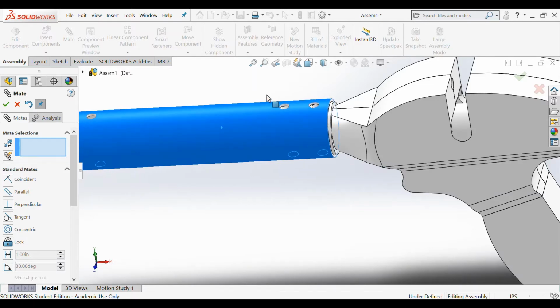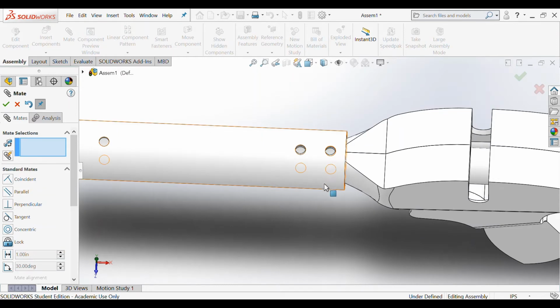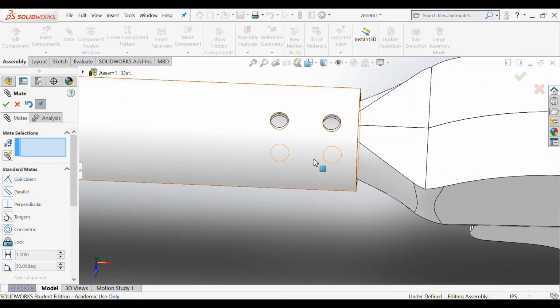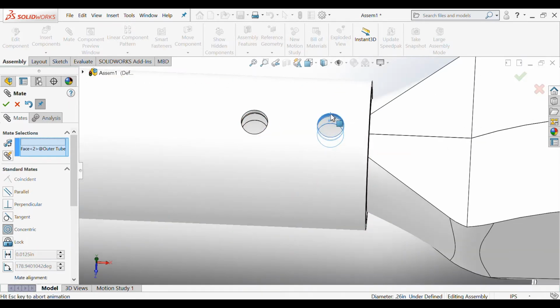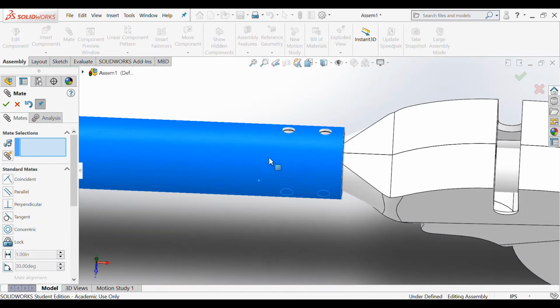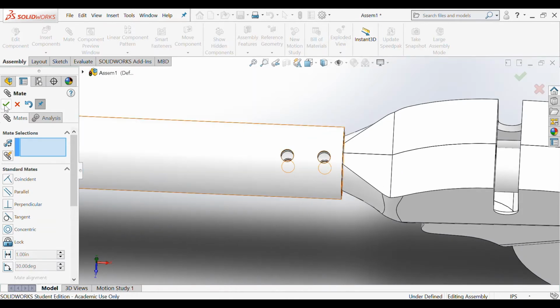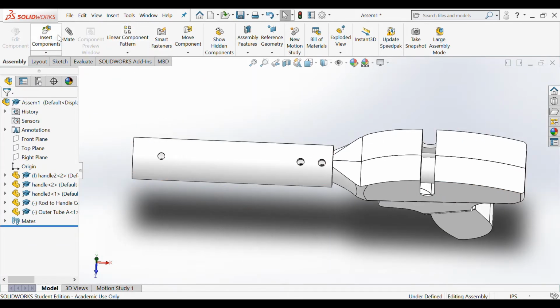Now I'm going to go ahead and rotate this guy. And we want these two holes to always stay aligned so we can put our bolts through it. So I'm going to go on ahead and click on the inner circle of the connector and then the inner part of the circle on the rod. And I'm going to make them concentric. And that way we can't move it anymore, but it still can rotate as for that 360 motion. Next, I'm going to insert the inner rod.